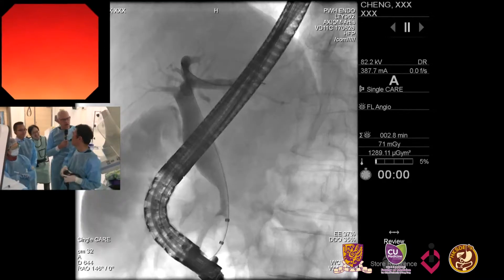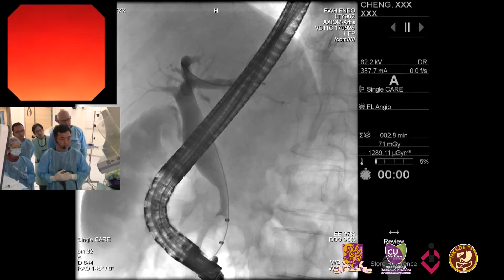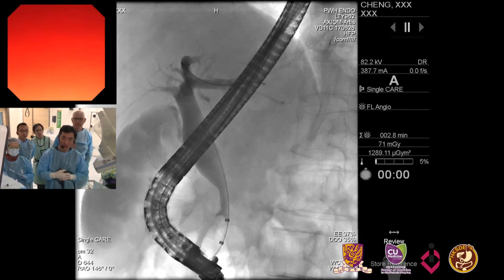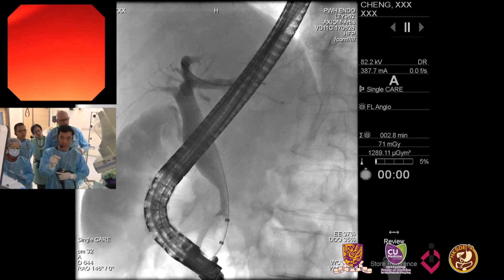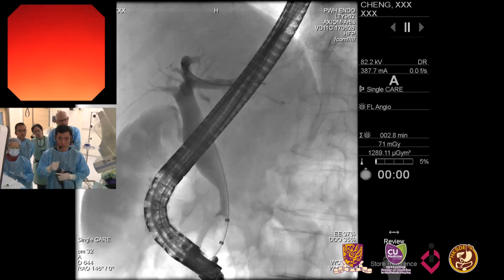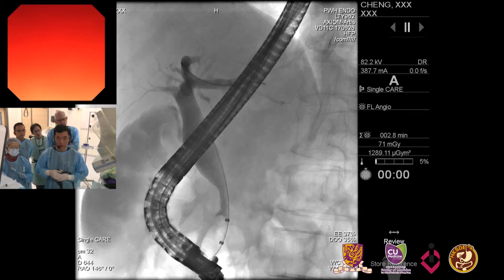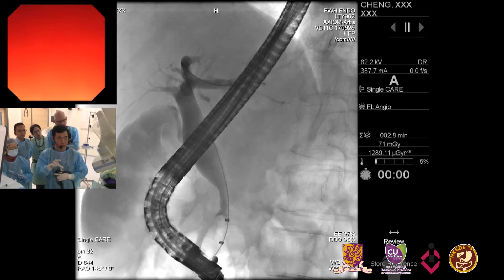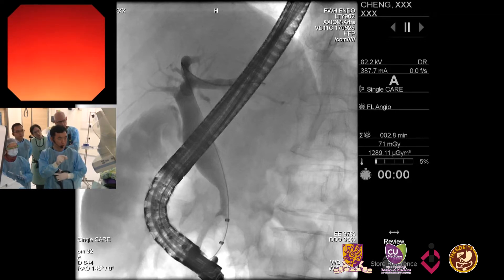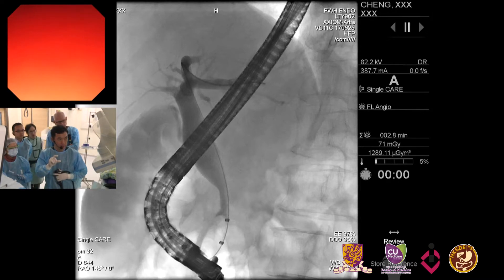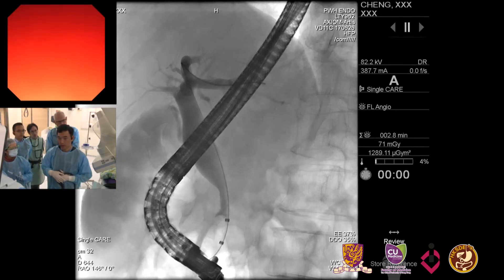We've asked for a balloon. On the occlusive cholangiogram, you can see the tightness in the distal duct is not as bad as we expected. We did several sweeps and actually a 12-millimeter balloon swept down without much resistance — you have to give just a little more force but it comes through. Once I situated the balloon at the distal end and injected, the bile duct stricture length appears to be about 12-13 millimeters, and the diameter is probably 4-5 millimeters on this cholangiogram, which is more than adequate.